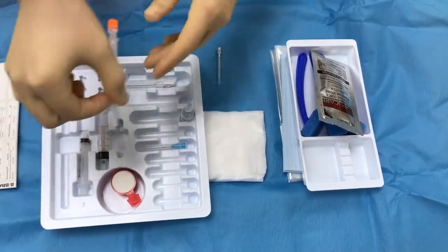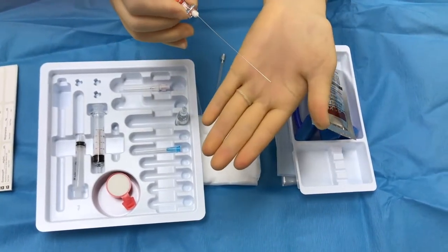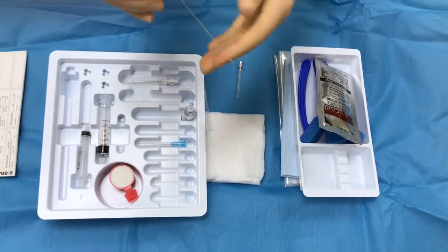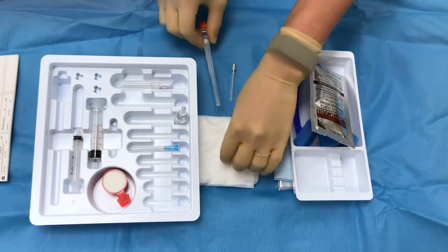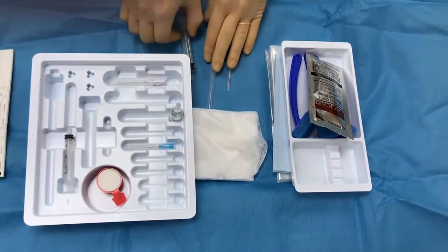And then you'll take your spinal needle. You'll notice it's very small, very thin. That's why you need the introducer needle, because this alone cannot penetrate all of the layers that you need to penetrate. Okay, and then they have a syringe for the actual spinal dose.